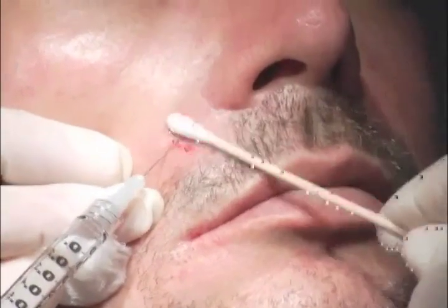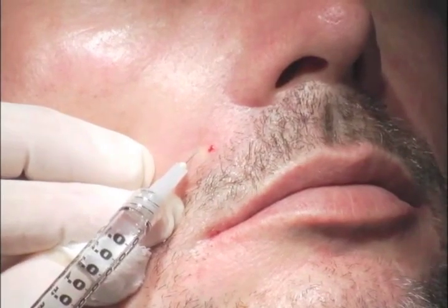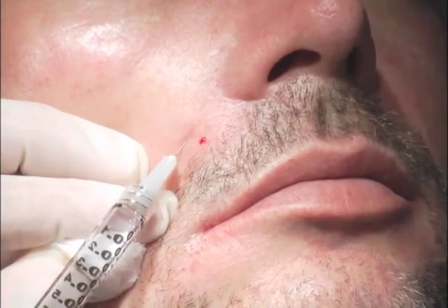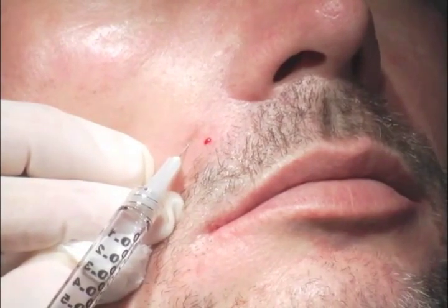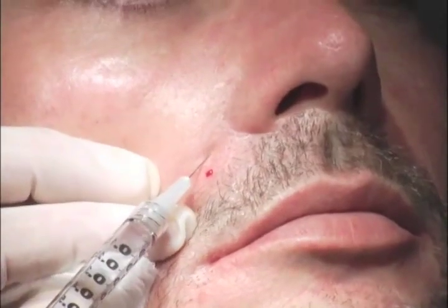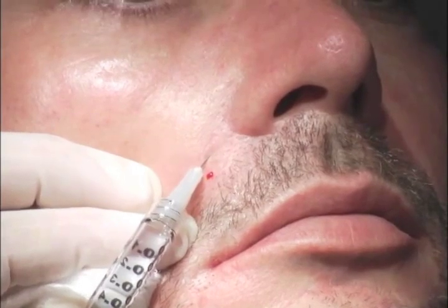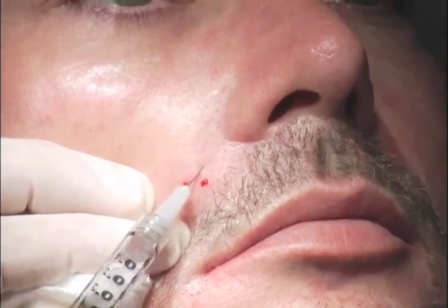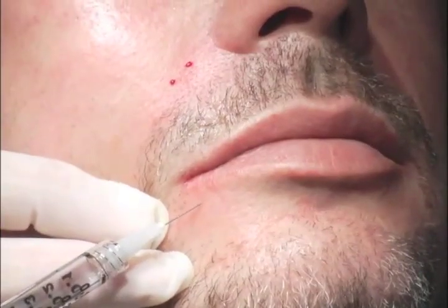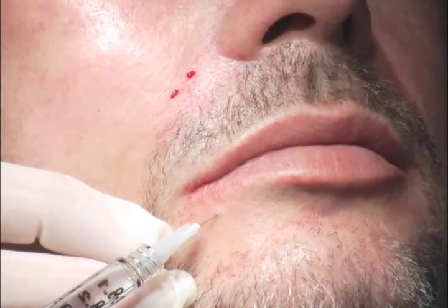And so we're going to go slightly lateral up here. Fill in the space. Again, doing this very, very slowly. Okay, and that doesn't hurt any more than the 30 when you go slowly. And the only thing I see is this one little dent under the lip right here, which you can see. And we'll do that just a wee stroke, get rid of that dent.